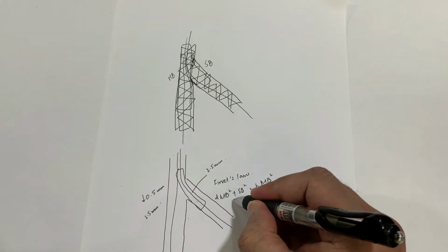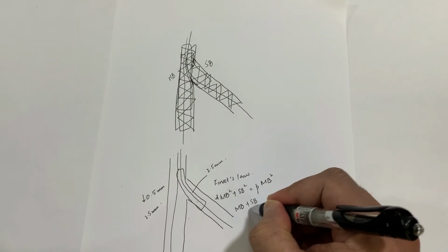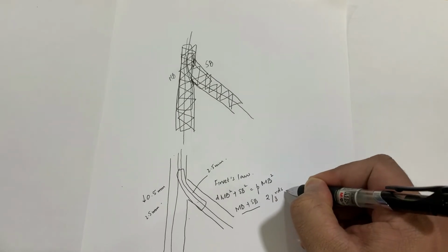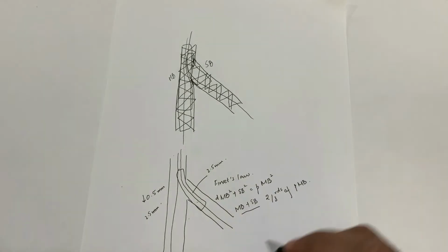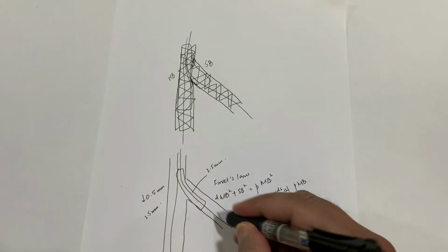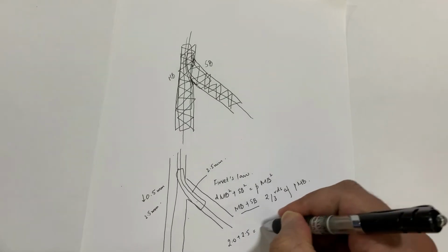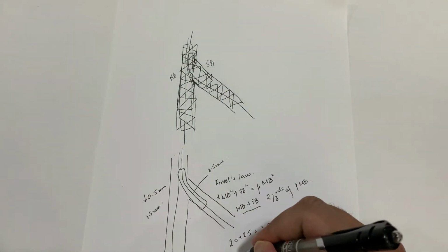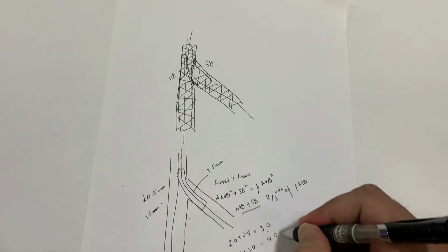Another easy way is that if main branch plus side branch are added, they are 2/3 of the proximal main branch size. Easy way to remember is if you have a 2.0 plus 2.5, it's good for a 3.0 proximal vessel. If you have a 2.5 plus 3.0 balloon, it's good for a 4.0 proximal vessel.